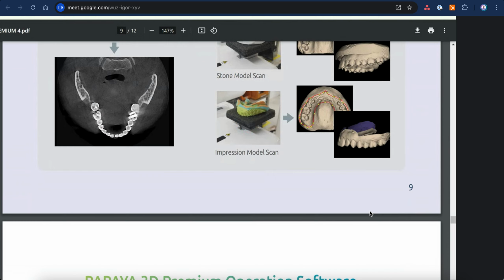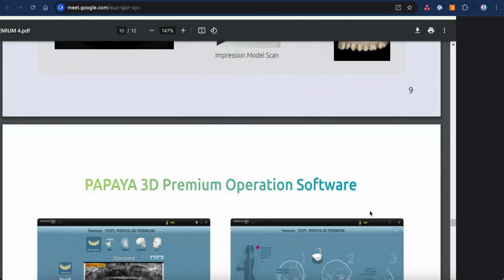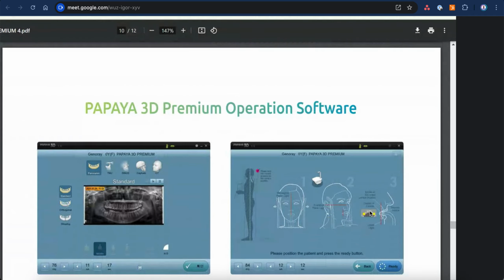And in the past, in the 70s and 80s, some men were proud to have a gold crown. Yes, and this can also cause the artifact, but we are seeing it less nowadays. This is the software.